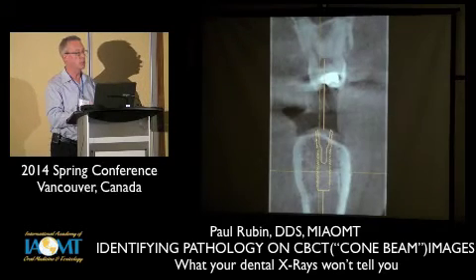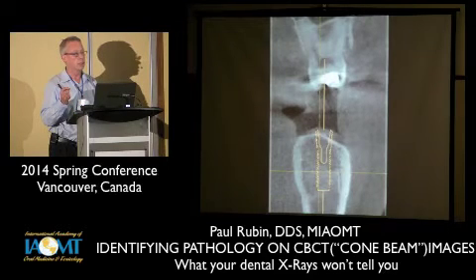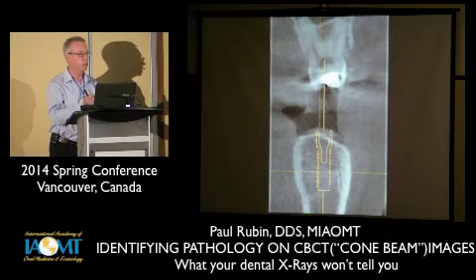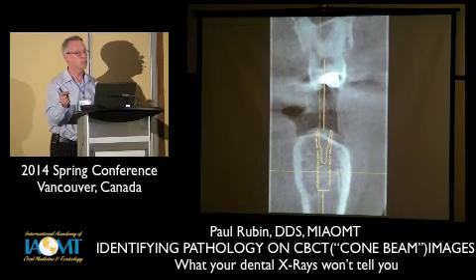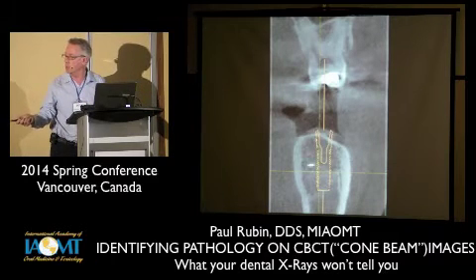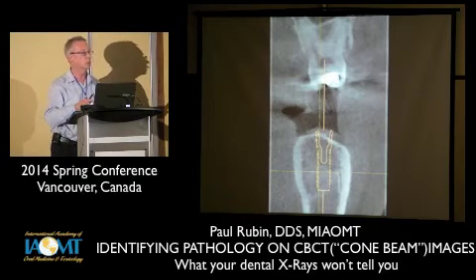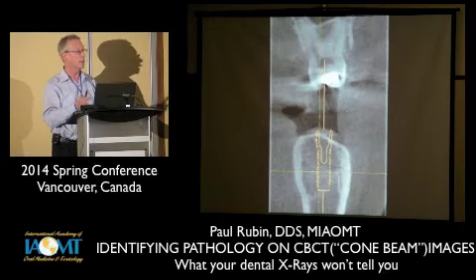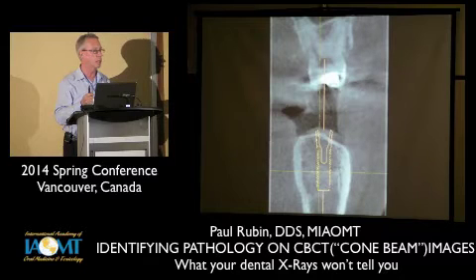So one of the neat things you can do on the software here is to virtually place the implant three-dimensionally. You can pick whichever brand, whichever size of implant you're planning on using. You click and drag that image over into your X-ray image. Look at this in three dimensions. You need to adjust it a little bit. You move it a little bit in this dimension, that dimension, rotate it, whatever you need to do until now I can see in three dimensions what the bone looks like around there, and I know this is the best place for my implant.